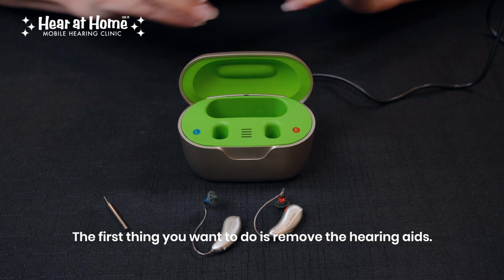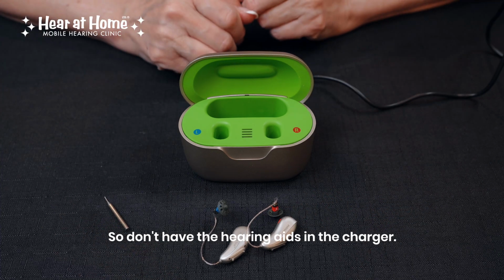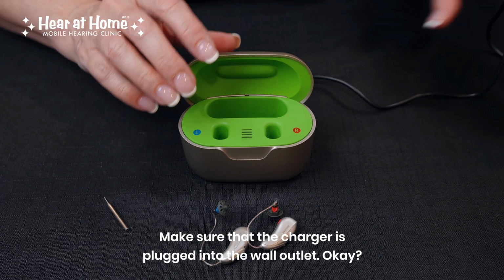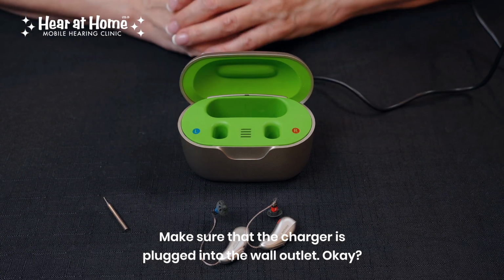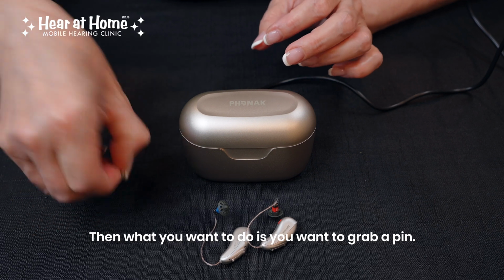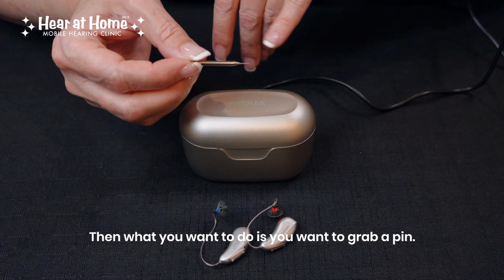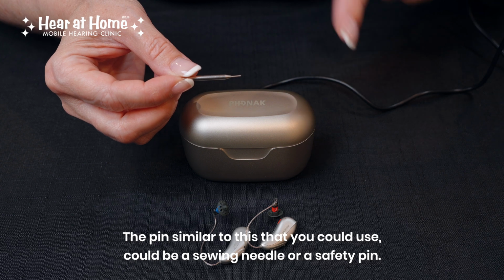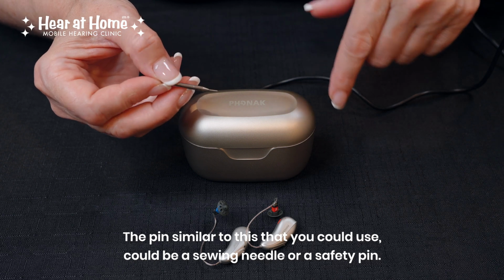The first thing you want to do is remove the hearing aids. So don't have the hearing aids in the charger. Make sure that the charger is plugged into the wall outlet, okay? Then what you want to do is you want to grab a pin. The pin similar to this that you could use could be a sewing needle or a safety pin.